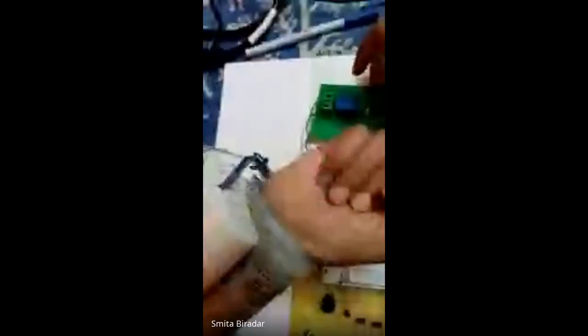It will be on after every 20 seconds. It will be checking continuously after 20 seconds. For that, I have used this system, sir, where it will measure the countdown till 20 seconds. It's off now. After 20 seconds, again it will show the measurements. Sir, it's uploading now. My data is uploading on the ThingSpeak app.